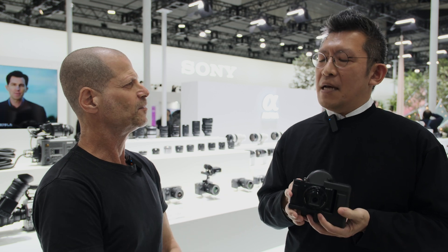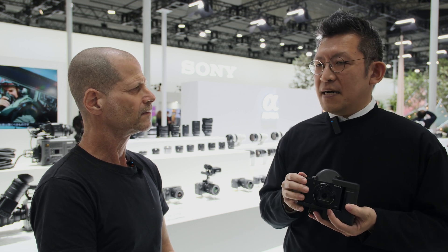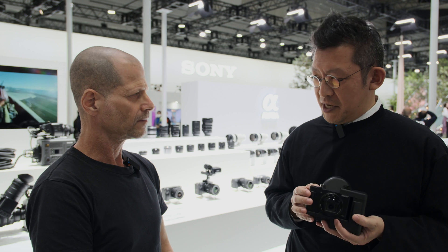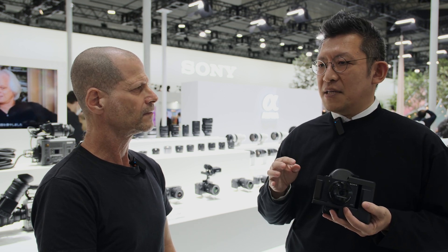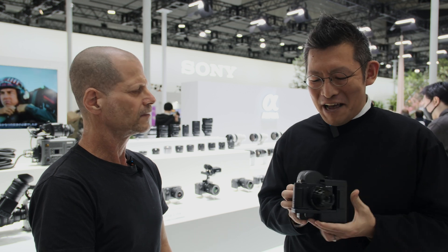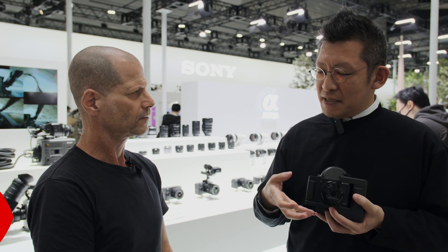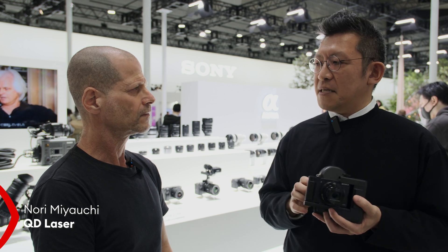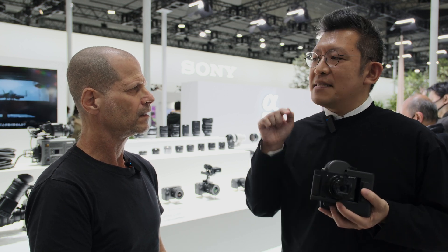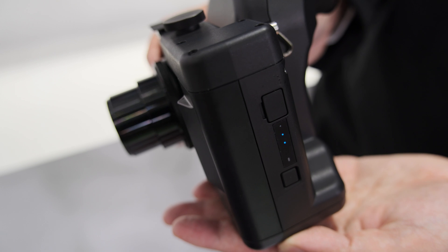How about pricing and availability? We will sell the device as this combination and the market price will be around $1,000 USD. This is the result of huge support by Sony — the camera itself costs around $800 USD, and actually the device alone is much more expensive than that. However, Sony provided huge support on this product, so you can buy the combination for around $1,000 USD. It will be available on March 24th in the Japanese market, sold in five Sony stores in Japan, and probably followed by the US market.